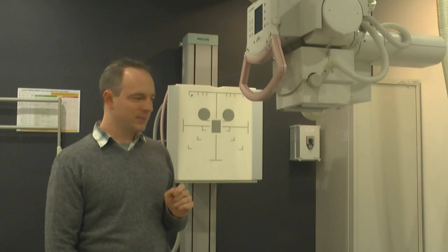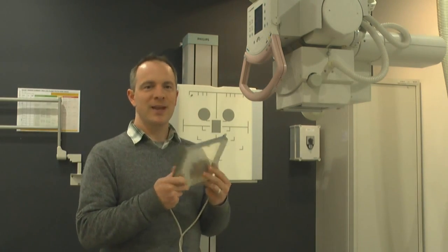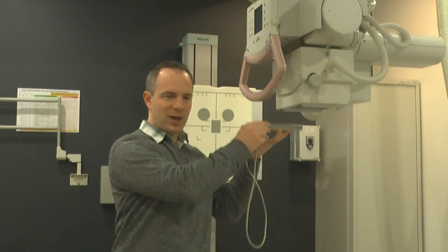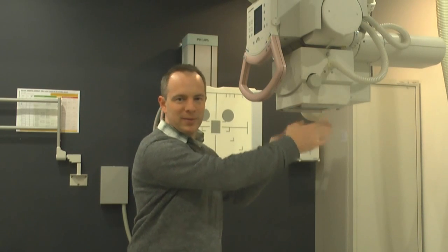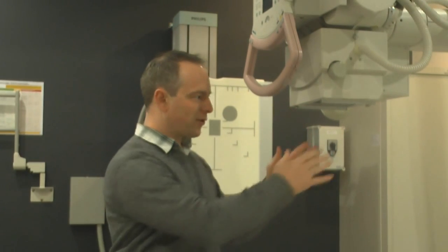So while we're imaging the knee phantom, we're going to be changing the mAs and the kVp and measuring the effect on dose. Now, the main benefit of using a dose area product meter like this is that the dose area product is basically independent of where we put the ionization chamber within the field path. That might seem counterintuitive because, as you've been taught, the X-ray beam is expanding as it propagates away. And you should know that the intensity of the beam will be reduced as the inverse square law. So the further away we get from the source, the weaker the beam is going to be. That also means that the weaker the dose is going to be.